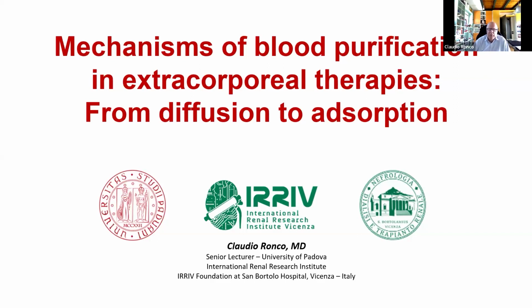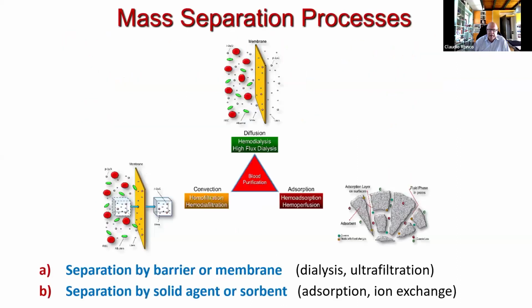And I'm happy to be with you today, speaking about the mechanism of blood purification in extracorporeal therapies. The topic may seem a little bit boring, but especially for young fellows, I think it is very important for knowing the basis of what's going on when we have any patient in extracorporeal therapy. Mass separation processes to remove solutes occur by barrier separation, as in the case of dialysis or ultrafiltration, and by solid agent, as in the case of adsorption.